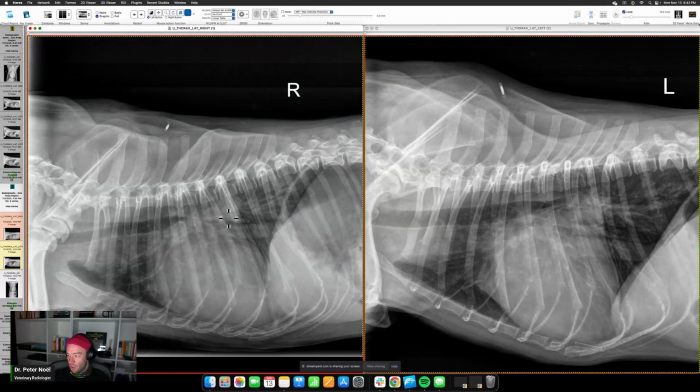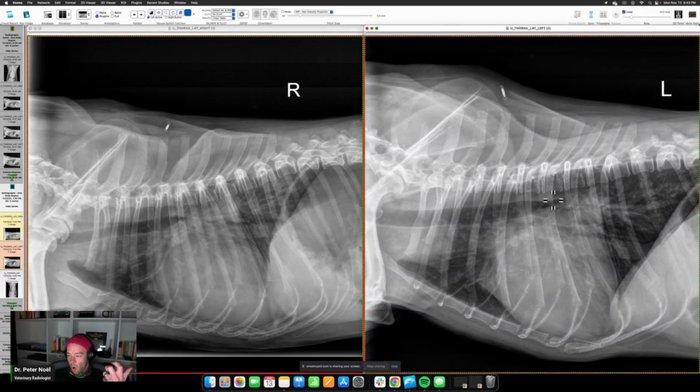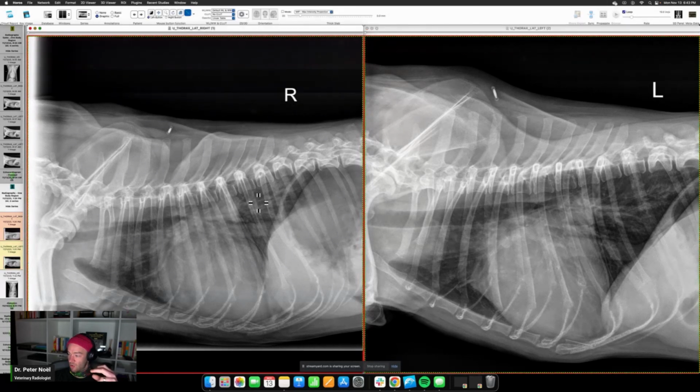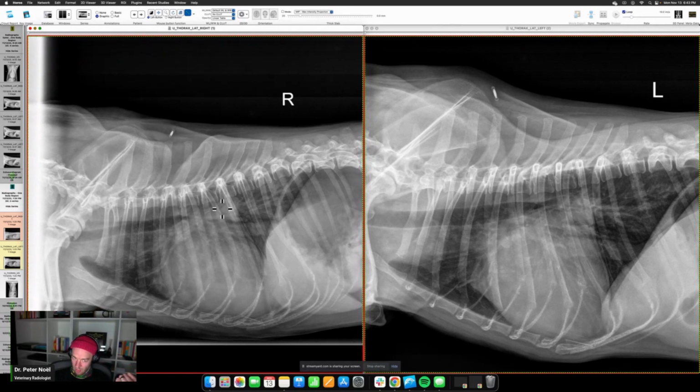So this is collapsed. This collapse could be from left atrial compression or impingement, because the left atrium is so enlarged. But what I find to be interesting is that it's dynamic. And so I wonder, because he's breathing in here, so it's opened up, and he's breathing out here, so it's closed down. So it's acting like a tracheal collapse. If you have intrathoracic tracheal collapse, when you breathe out, it collapses down, and vice versa. So the dynamic change in the principal bronchi width, to me, raises concern for chondromalacia or bronchomalacia, in addition to compression or impingement from the enlarged left atrium.